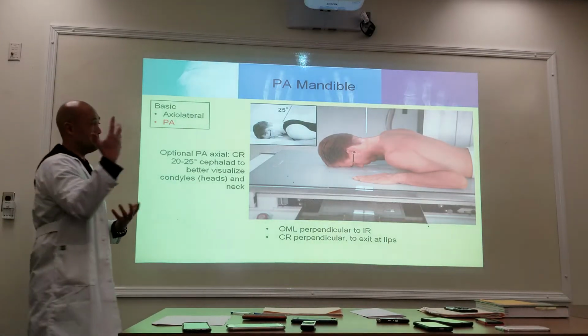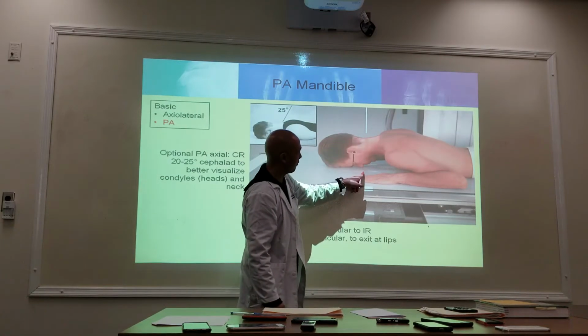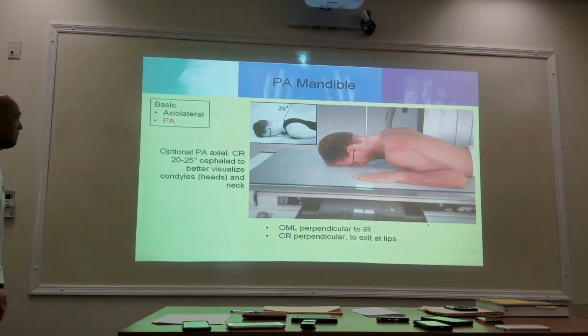Again, we said this earlier, well, how do I know where to center? Well, don't look at centering here, look at where the crosshairs are as it's exiting, and put that at the level of the lips. Okay.